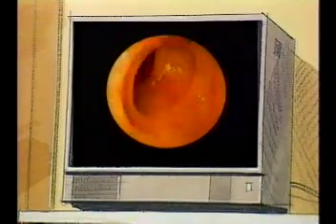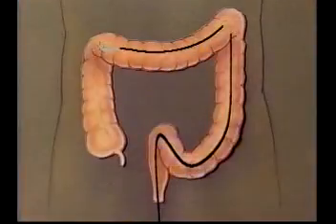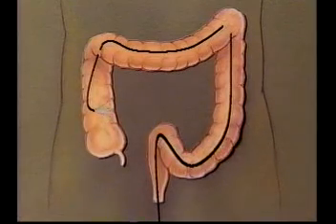Because the colon expands and contracts in length, it is not usually necessary to insert the full 5 feet. The amount inserted will be sufficient for examination of the entire colon, from anus to cecum, and on occasion into the lower end of the small intestine as well. The entire examination will take about 30 minutes.